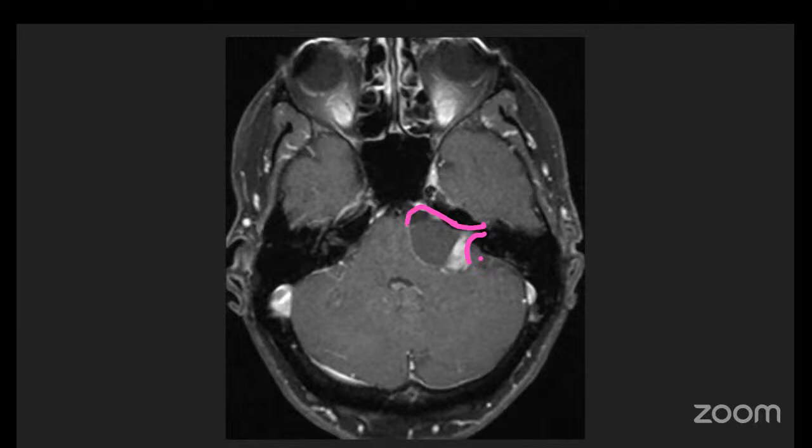The lesion is completely filling up the CPA cistern, also compressing the brain stem. I would not call this displacement; I would say that this is compressing the brain stem. Apart from that, you can see that the contrast uptake is heterogeneous. There is a visible cystic component within the lesion here. So this here is the cystic component of this lesion. Rest of it is solid.